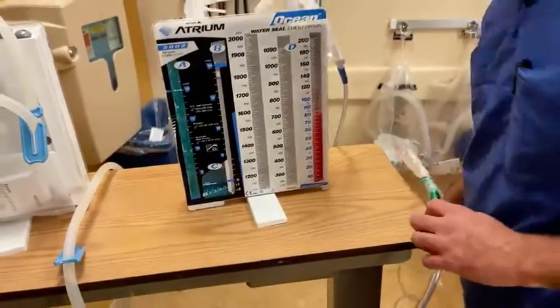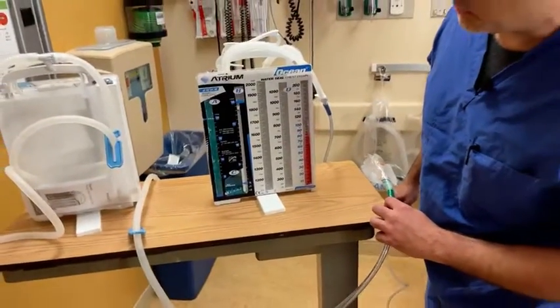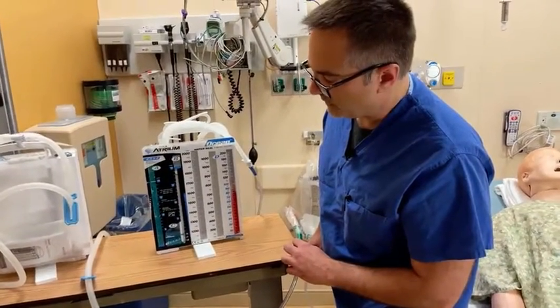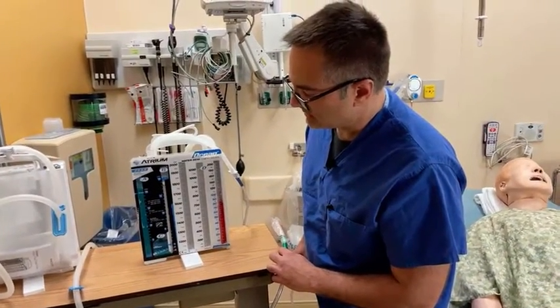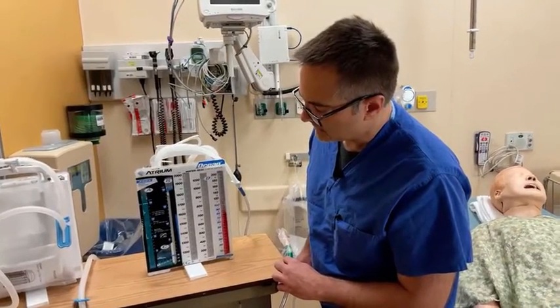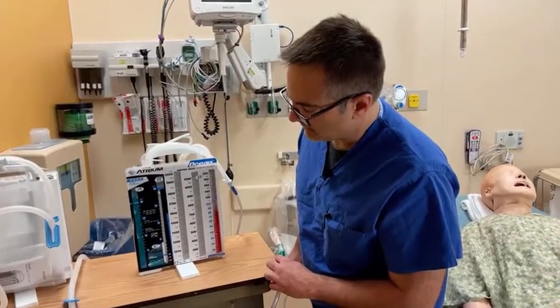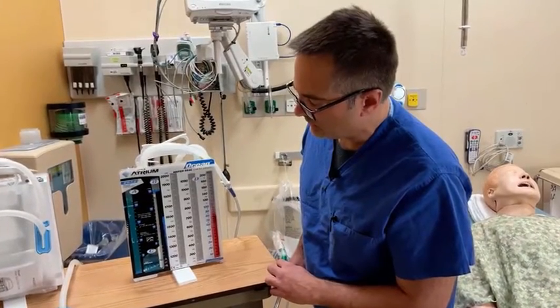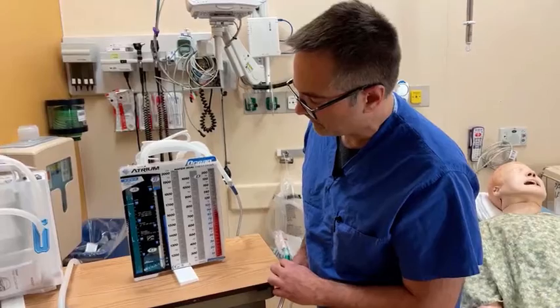Now ideally we want the suction to be more gradual if possible. The more vigorous the suction, it does less good, it just evaporates more water. So something along the lines of a gentle boil is really all you need for the suction control chamber.